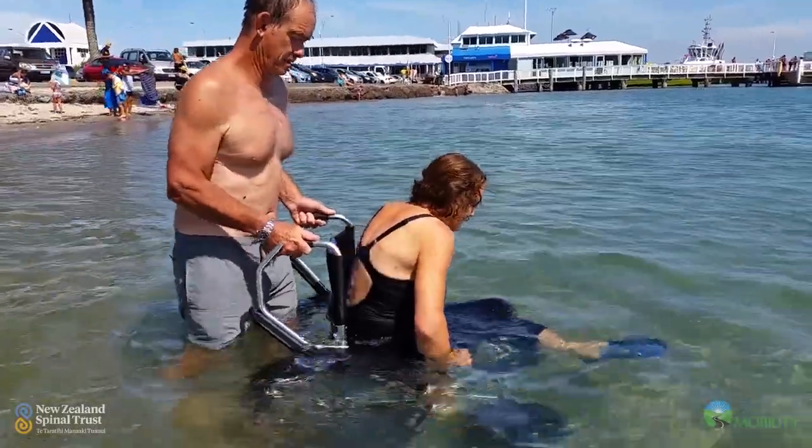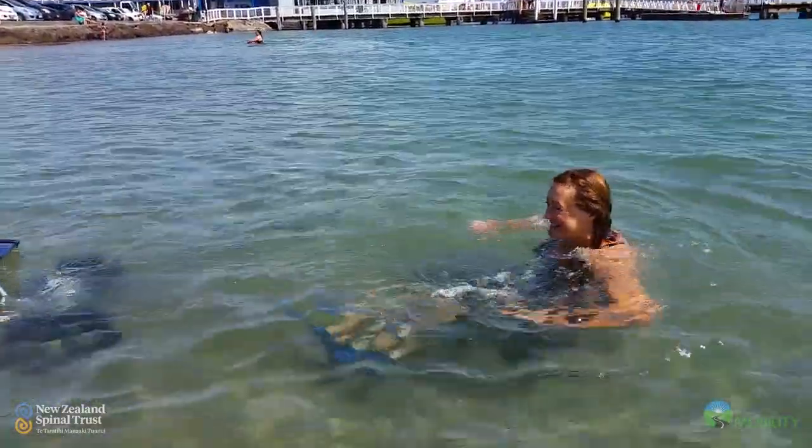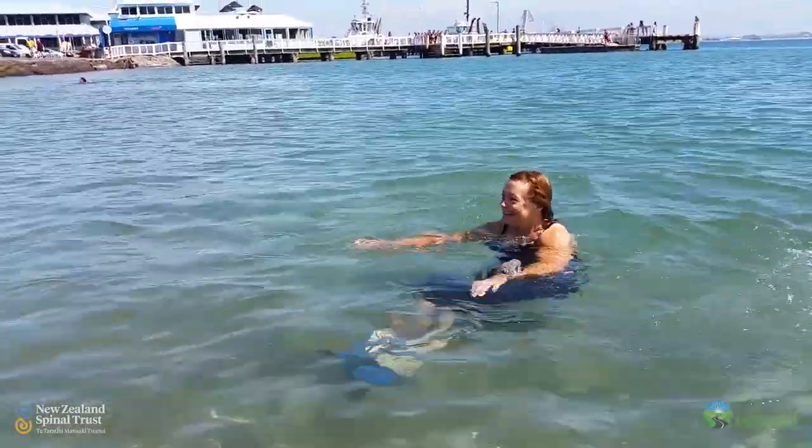We could easily access the soft sand and the hard sand and the water. It's an easy transfer because it's at wheelchair height.